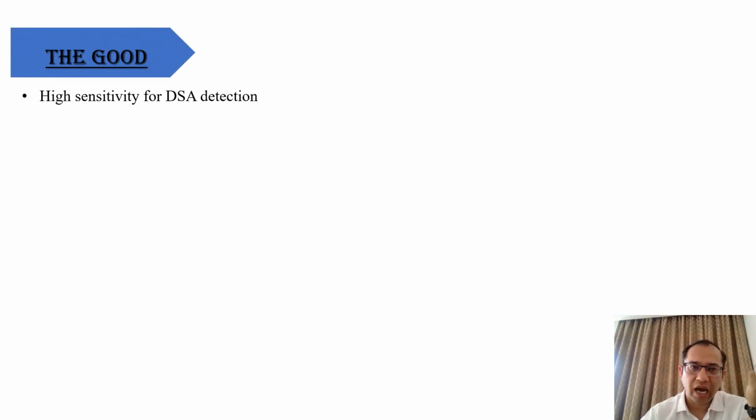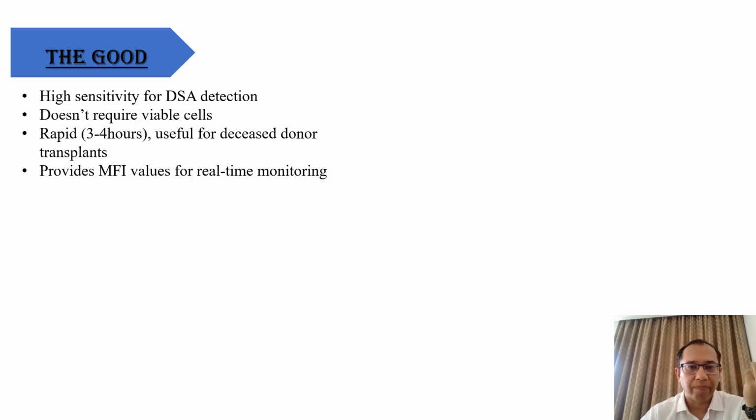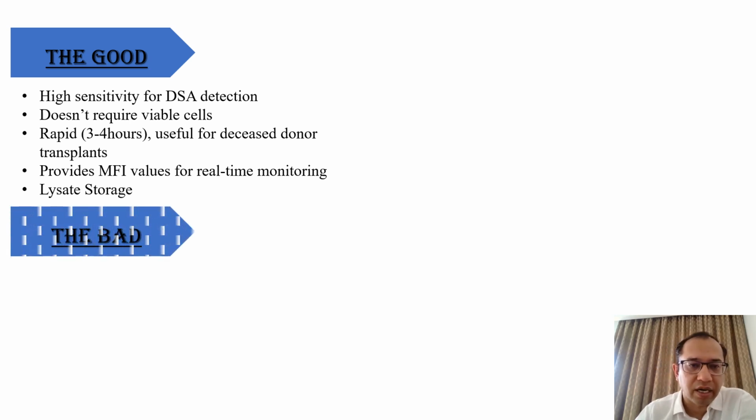That it has a very high sensitivity for DSA detection. This test doesn't require viable cells. It is a very rapid test, provides MFI value for real-time monitoring. You can actually monitor them, and lysate storage can happen up to 1 year. So we can store the lysate, and even for a cadaver or cadaveric transplant, when you require the donor cells, it is very handy at times.